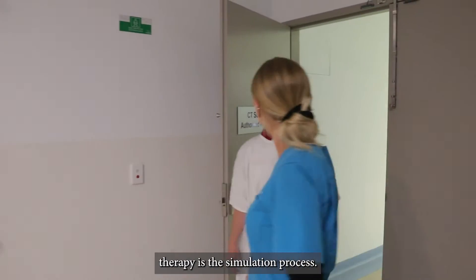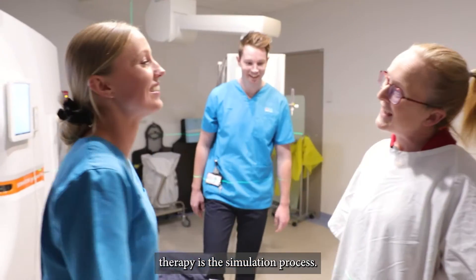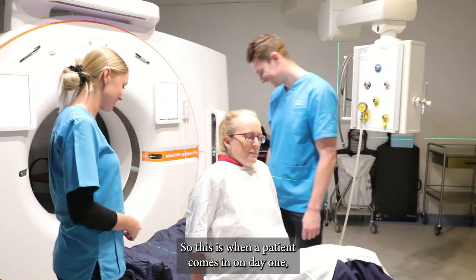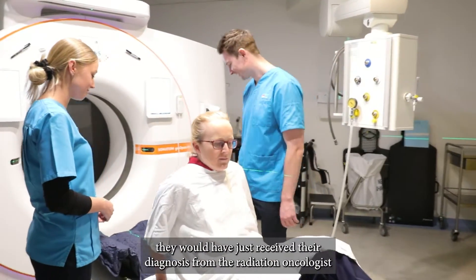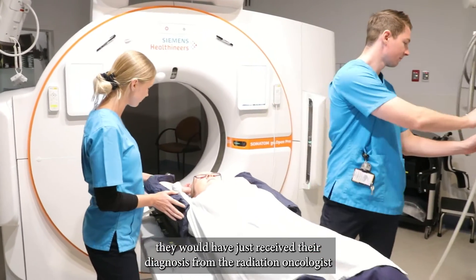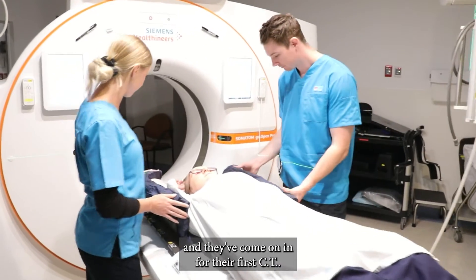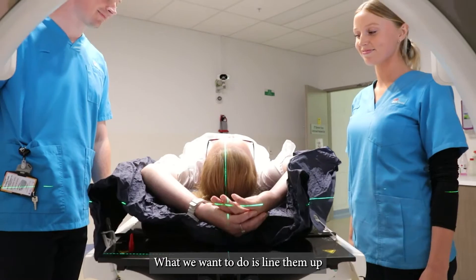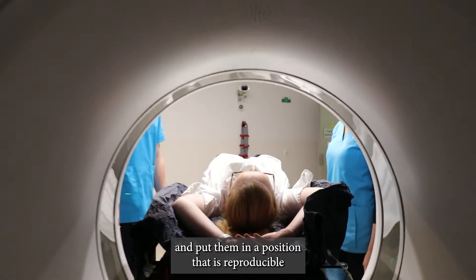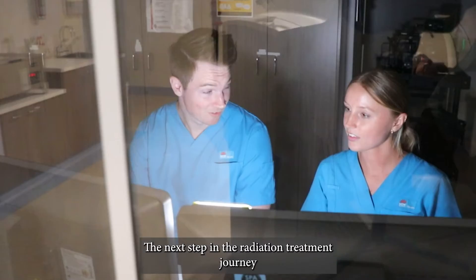Step one of the radiation therapy process is the simulation. This is when a patient comes in on day one — they would have just received their diagnosis from the radiation oncologist and they've come in for their first CT. What we want to do is line them up and put them in a position that is reproducible, so we can repeat it day to day for treatment.